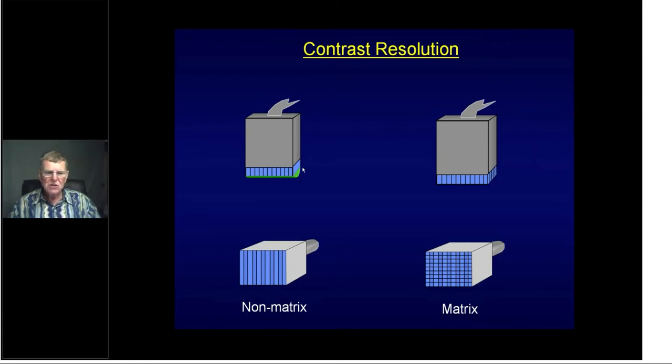Conventional transducers will have a lens across the slice thickness plane with the transducer elements going across like that. And the lens will focus in that plane, and it will be moderately thick, especially when you get away from the set, fixed focal depth. But a matrix transducer has multiple elements across the face, and as you focus the beam down axially, it will also focus the beam across in the slice thickness plane. Brilliant. But they're expensive. Your machine may not have matrix transducers available. If it does, it will improve contrast resolution.